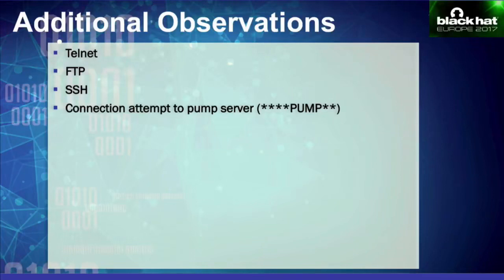We also noticed that when connected to the lab network, the infusion pump tried to reach out to a server. It was trying to resolve a NetBIOS name, which wasn't there. We figured that because infusion pumps usually talk to the pump server, it was talking to the pump server. We didn't have a pump server on our lab network, so we just spun up a virtual machine, gave it the same NetBIOS name that the pump was trying to resolve, and put it up on the network.